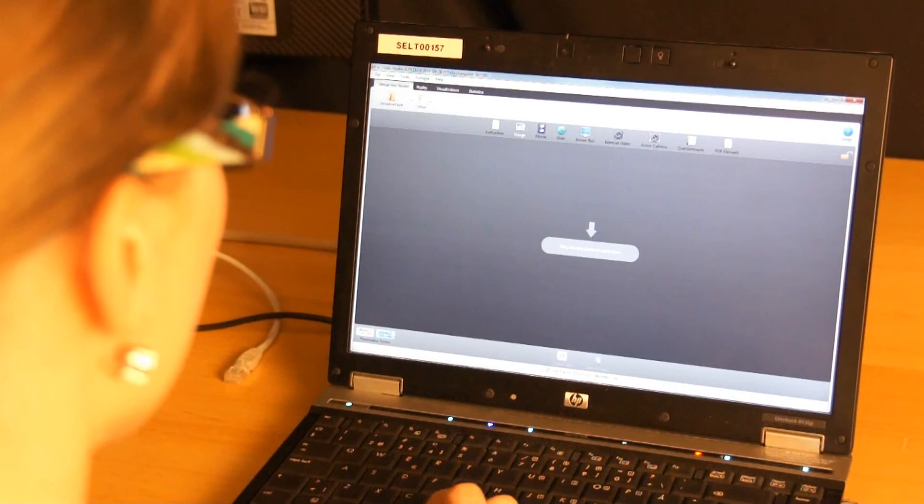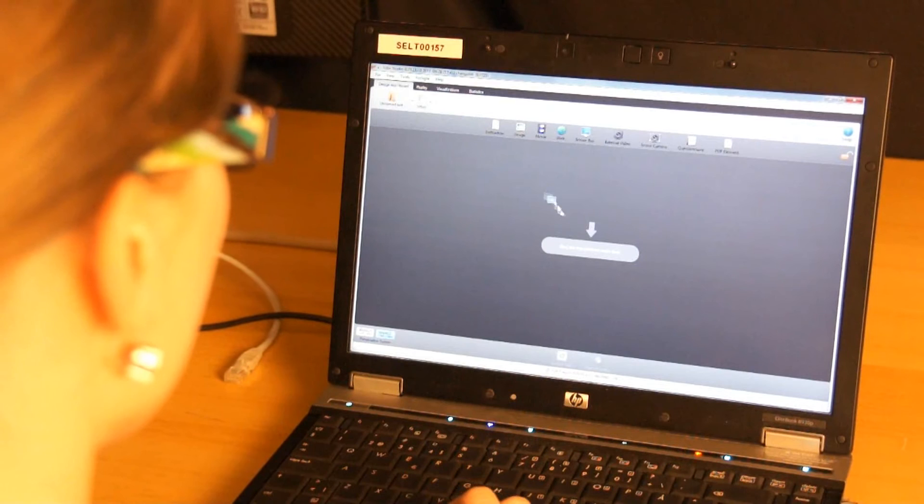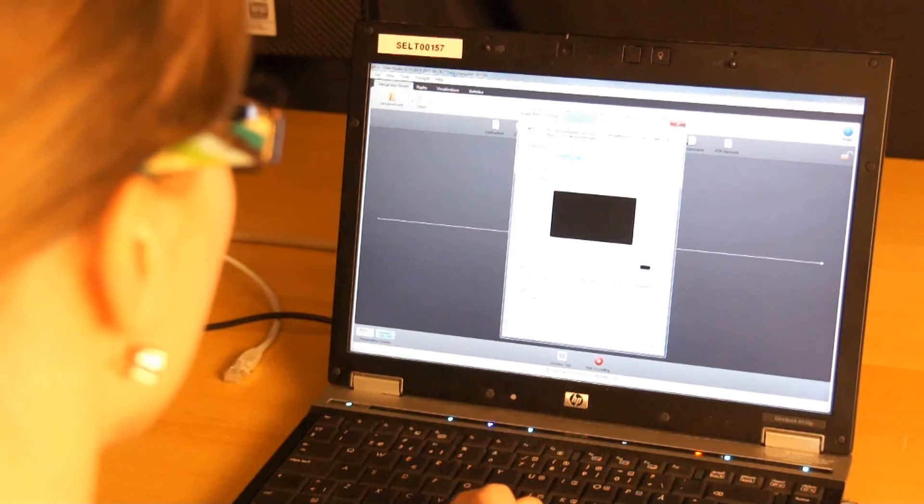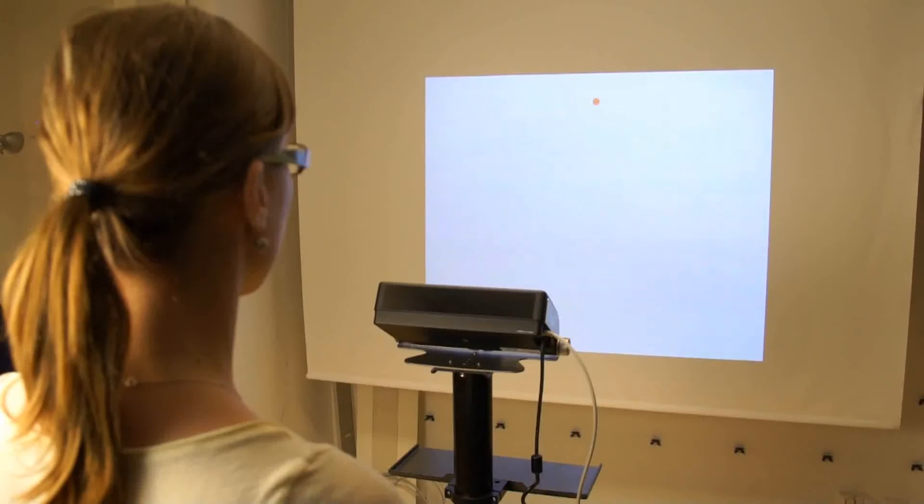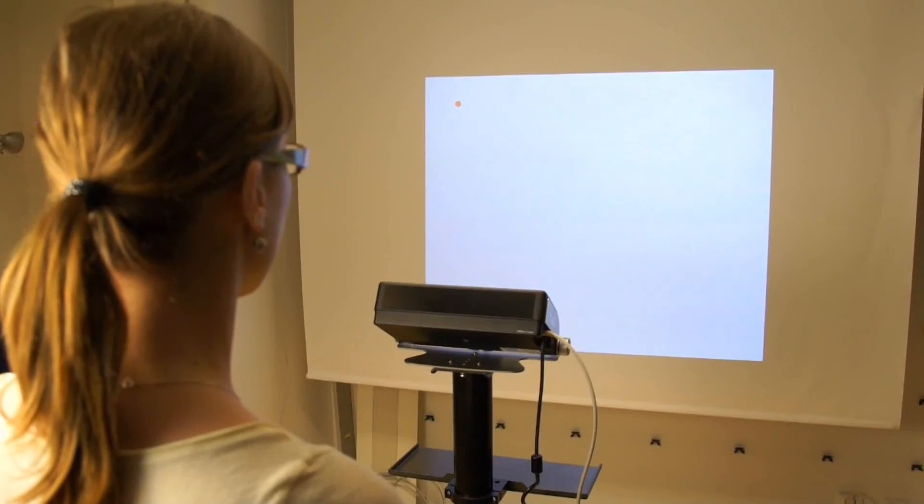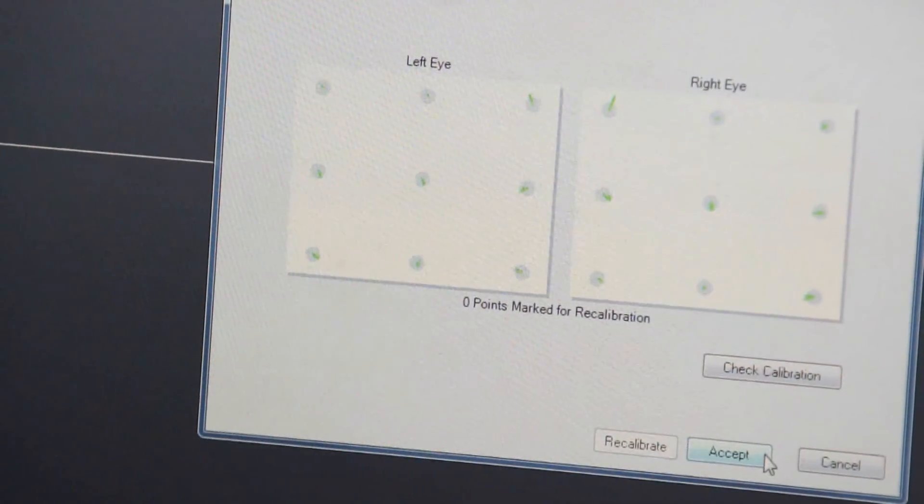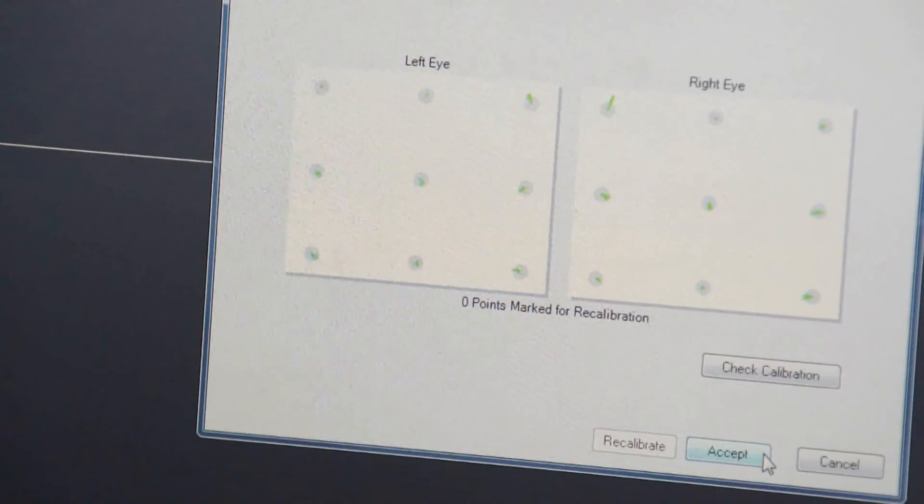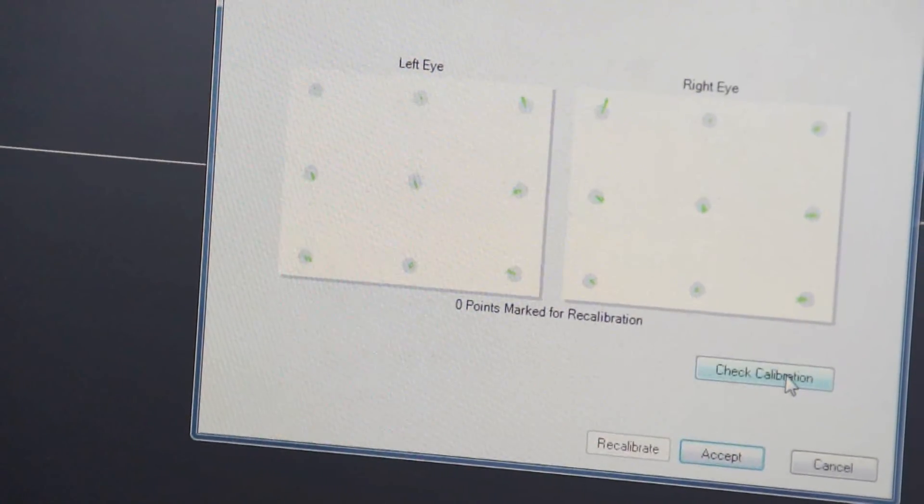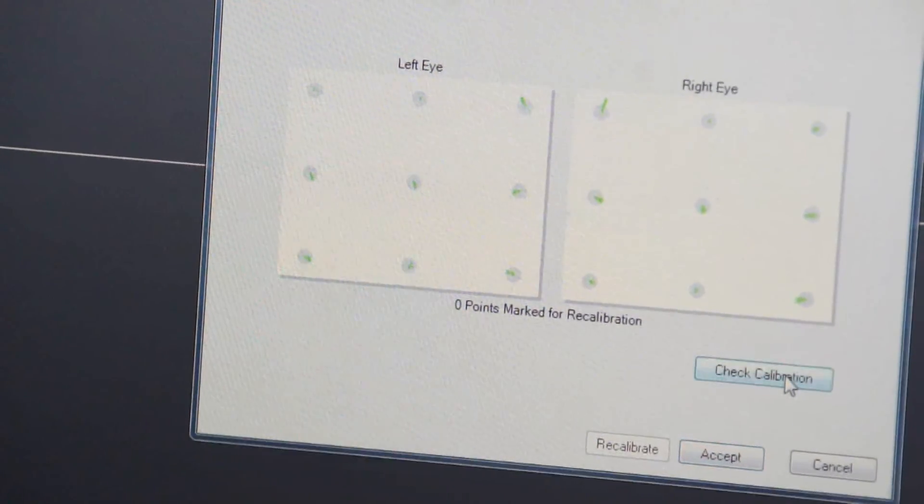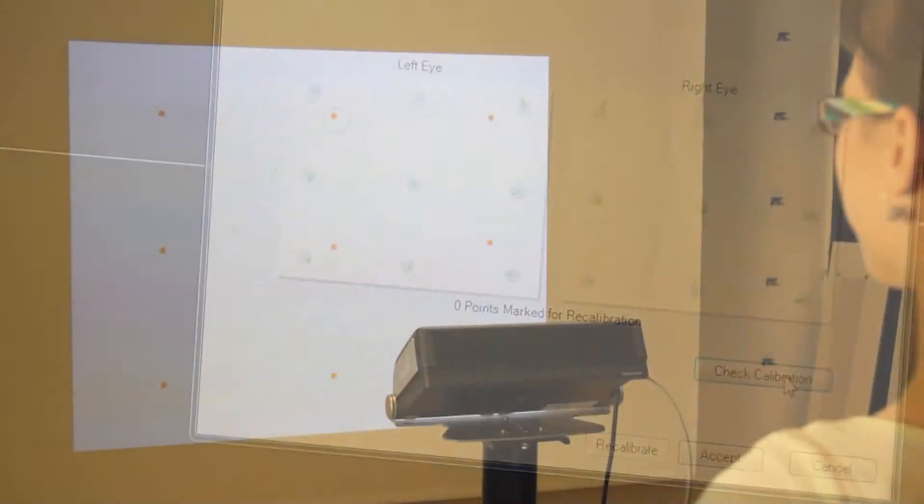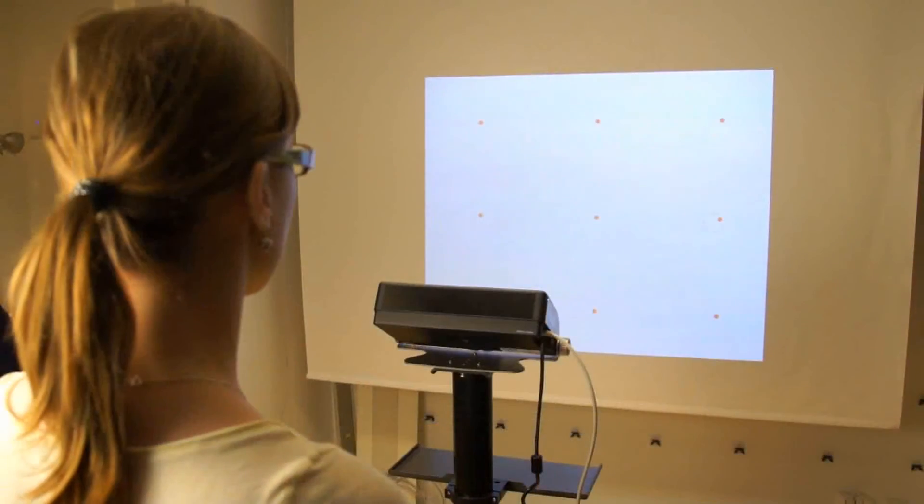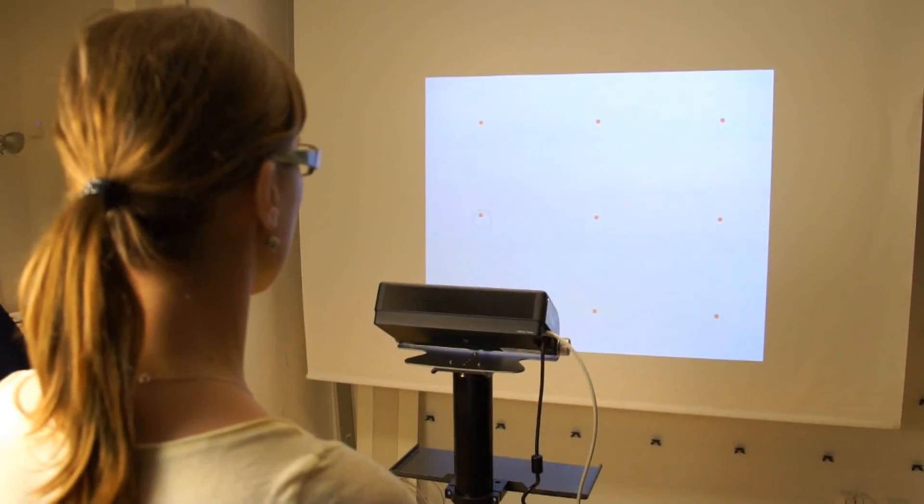Make sure that the test in Tobii Studio contains at least one stimuli. Click on Recording. Follow the calibration procedure and make sure that there is some data gathered for all points. Click the Check Calibration button and verify that no systematic offset is present and the eye tracker is able to pick the participant's eyes up for every part of the screen.